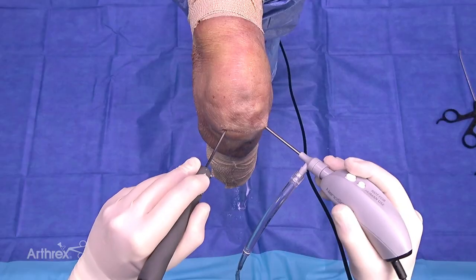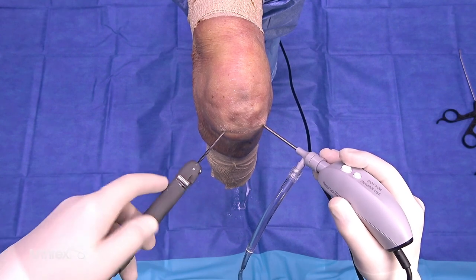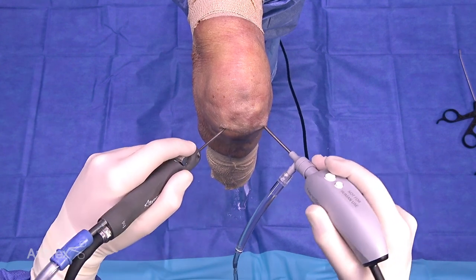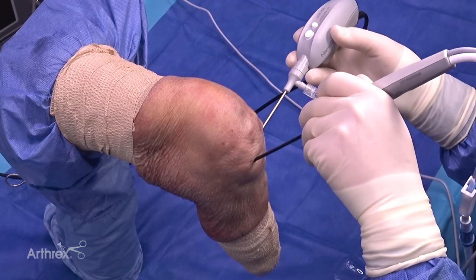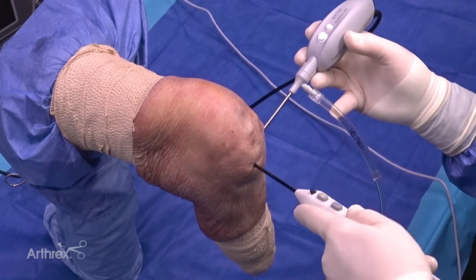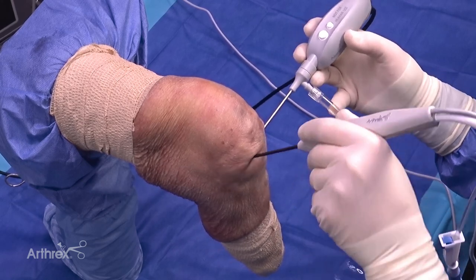The way that I can hold this is very ergonomic. I don't have to hold it with my elbow up in the air — I can hold it like a pencil with my elbows down, and this is actually very easy to do. We've got the SJ50 in the joint now. I can hold this very ergonomically, like a pencil, with my elbow down, and that makes it very easy and comfortable to use.